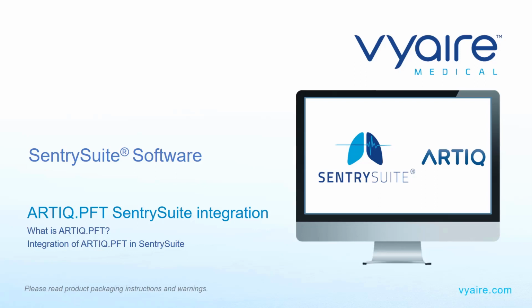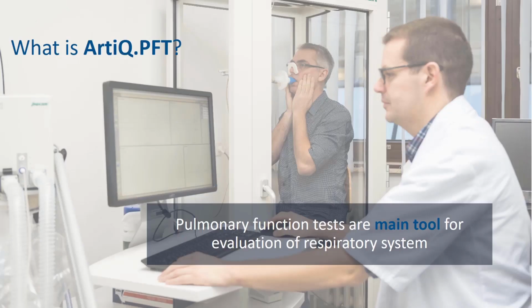We will provide you with an understanding of what ArtiQ PFT is and show you how ArtiQ PFT is integrated into SentrySuite. Part 1. What is ArtiQ PFT?